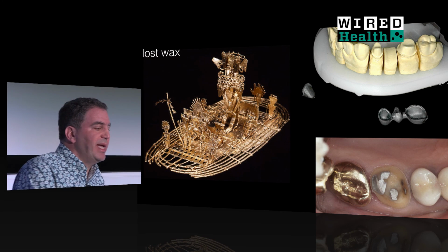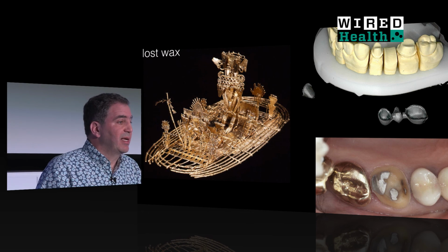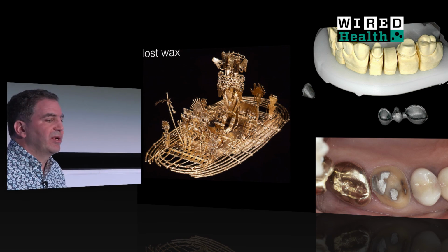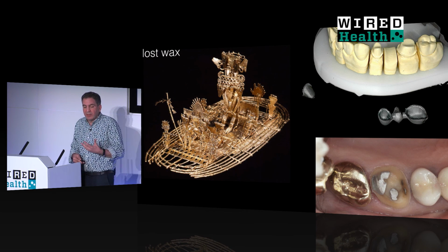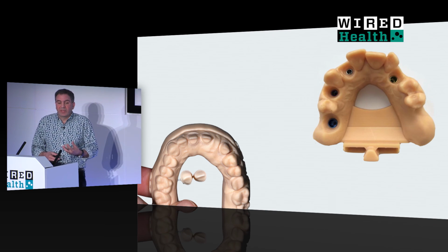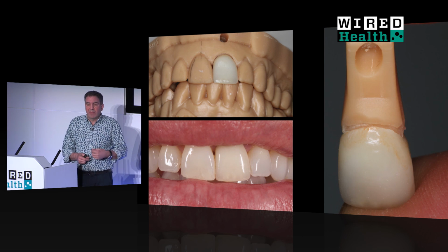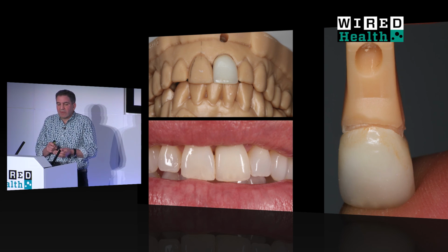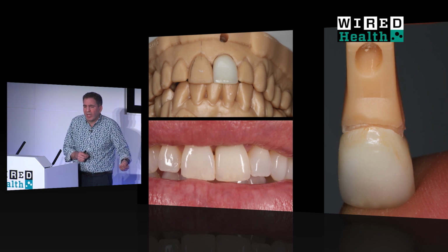This is how people make jewelry. And it's probably how many of your dentists make things like gold crowns and porcelain restorations. But this is all changing because now we are using 3D printing where before we used plaster of Paris. We're using 3D printing and 3D milled ceramics where before someone had to carefully structure the whole thing using difficult artisan processes in a basement somewhere.